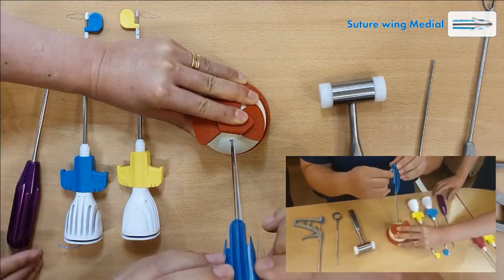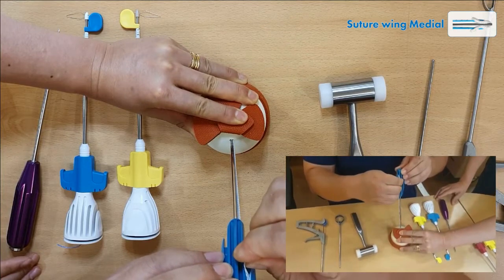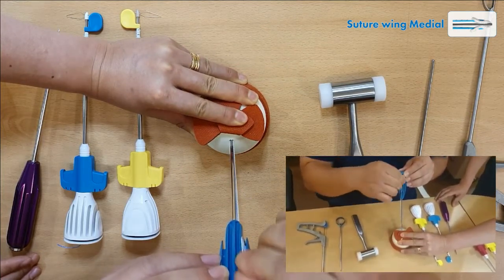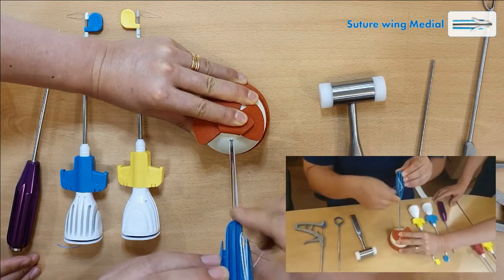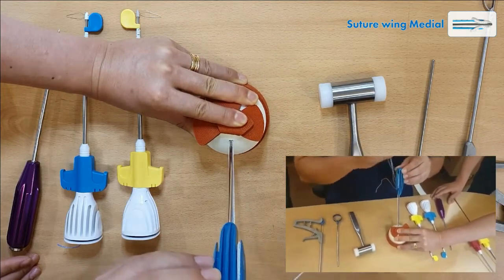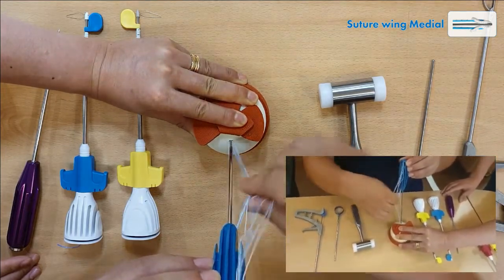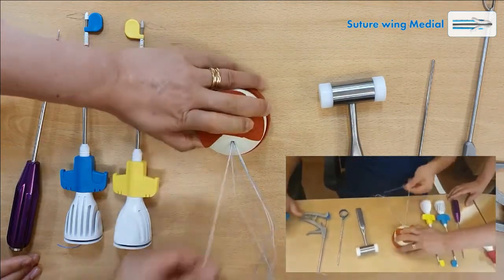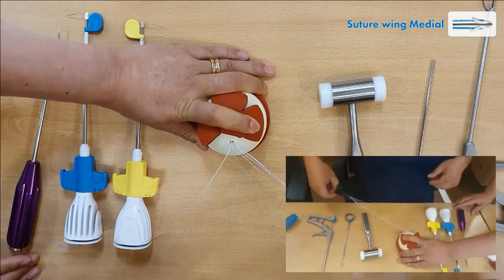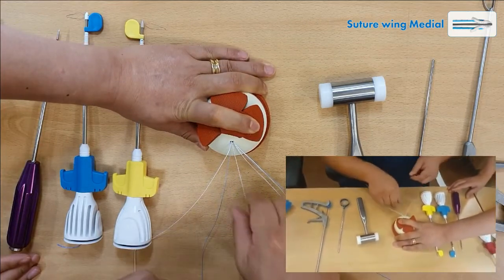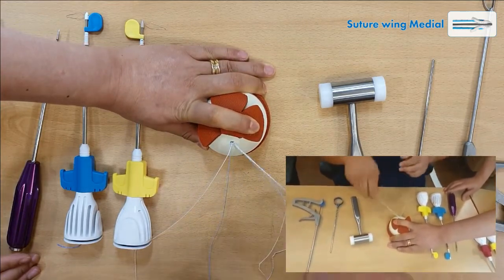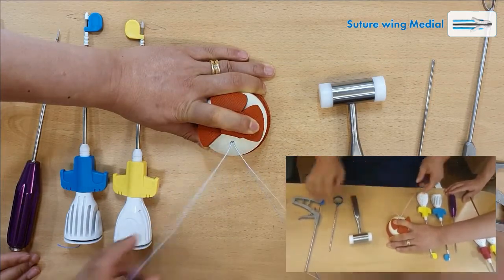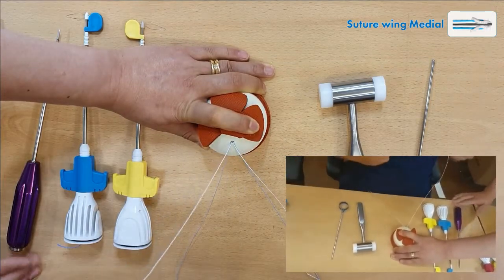We're going to remove the final wires from the anchor. This is triple loaded. We're going to use just two. I'm going to pull one out. Now we have double loaded fiber wire.